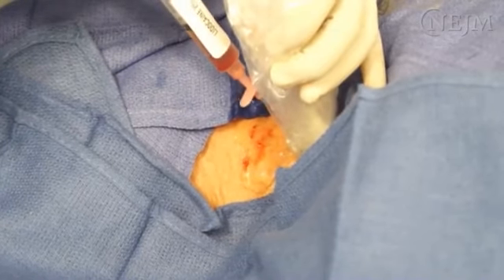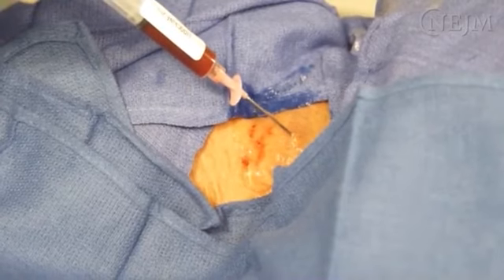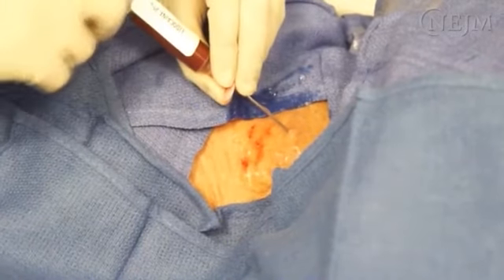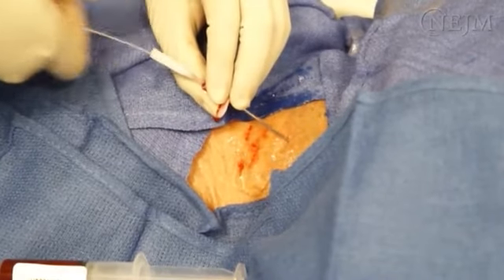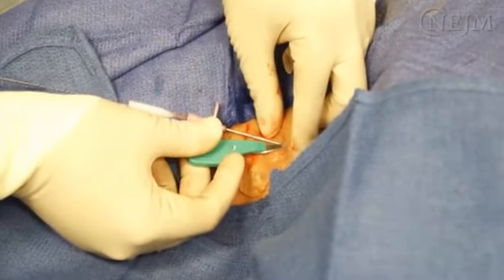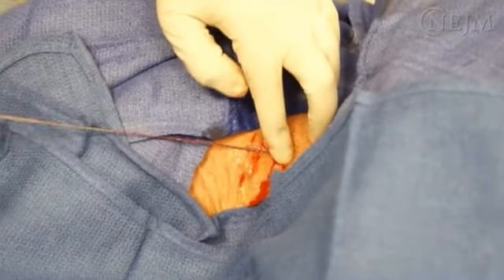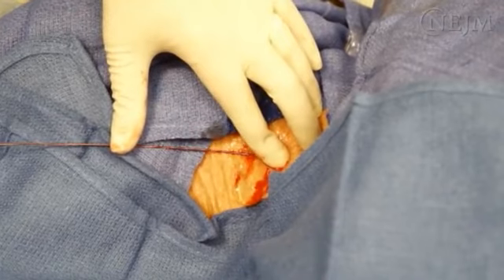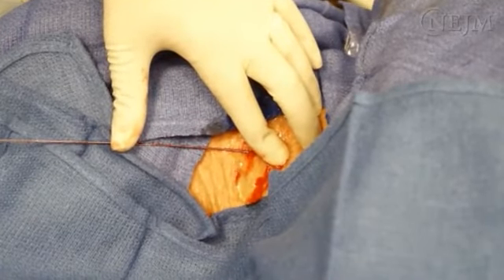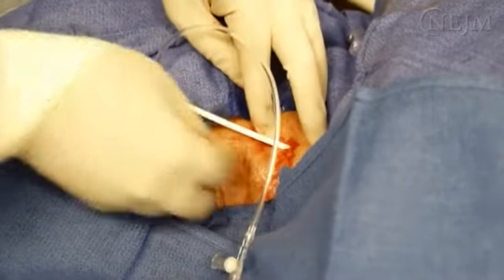If you are cannulating an internal jugular or femoral vein, use ultrasound to guide the needle. Once dark red, non-pulsatile blood is aspirated, remove the syringe from the needle and insert the guide wire. Use the scalpel to stab the skin adjacent to the needle and then carefully remove the needle. While stabilizing the guide wire to ensure that it remains accessible and does not embolize, insert the sheath and obturator over the guide wire until the hub of the sheath fills the incision.